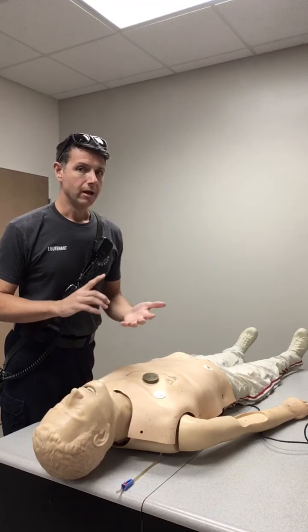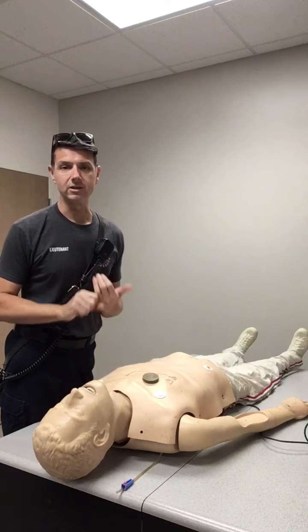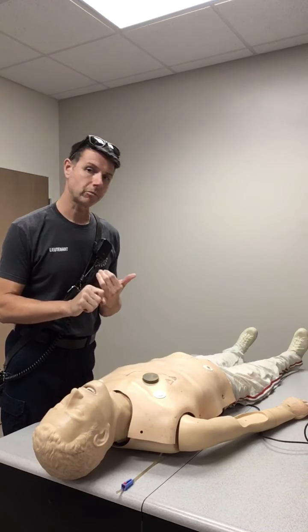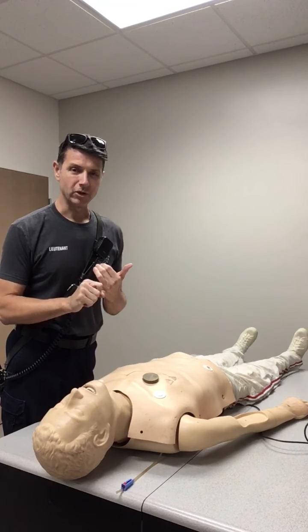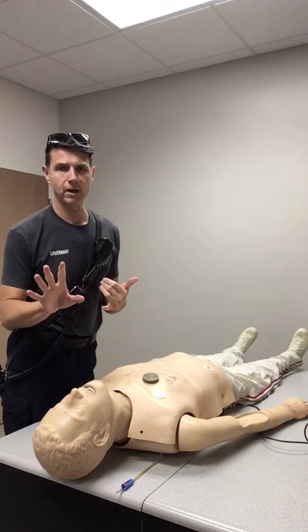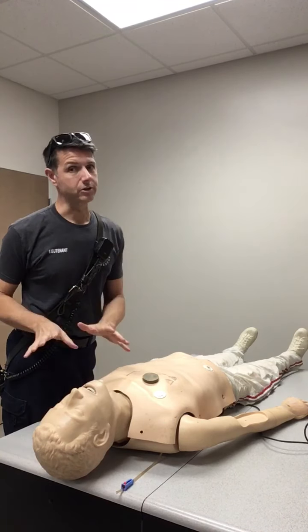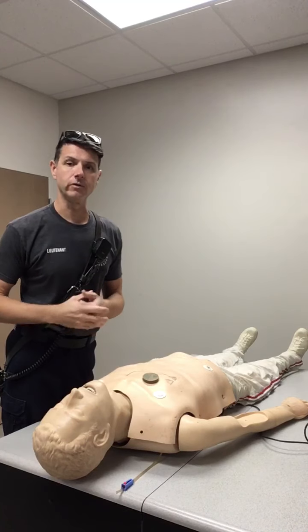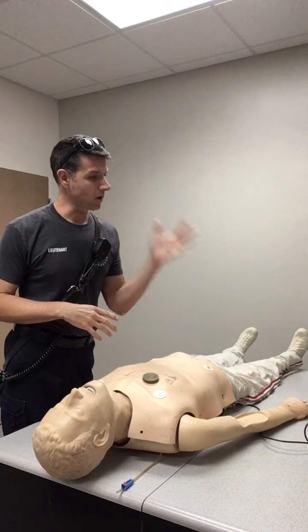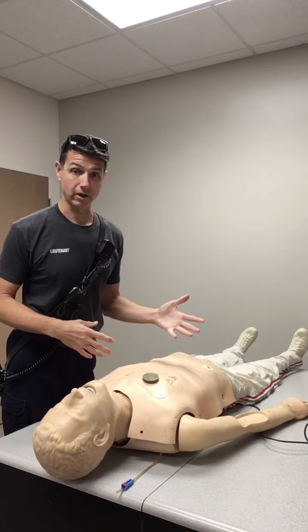All right. Good rule of thumb. If during your airway assessment you have inserted an adjunct, an NPA or an OPA, preferably an OPA, then you're probably going to have to bag your patient. So just keep that in mind. They typically go together. Other way around, if you decide to bag your patient, ask yourself if you've inserted an OPA. There's no penalty to go back, say, hey, you know what? I'm going to go ahead and drop in an OPA while I assist my patient with their ventilations.